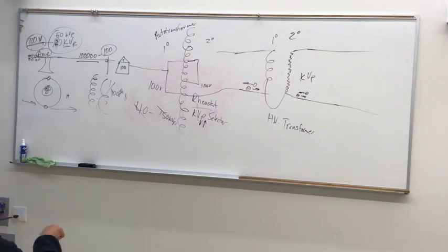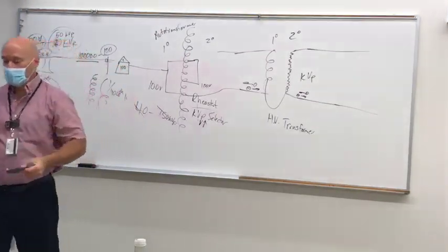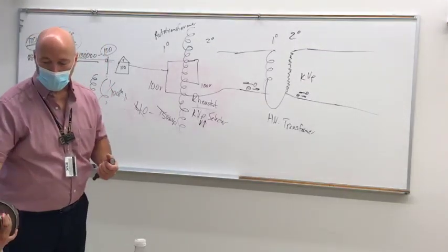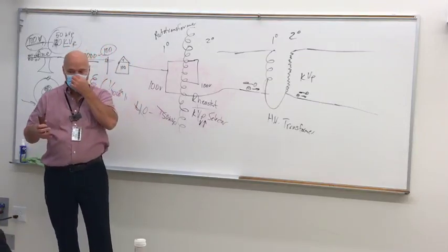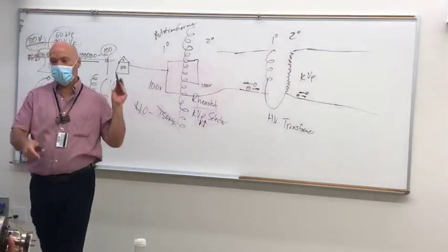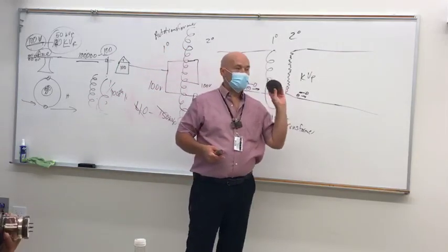Where's my filament? What I want you to do as you look at these is look inside, and what you'll see is a disc. And if you turn that tube, what you'll notice is the disc turns with it. There's a purpose for it turning. At the other end, what you'll see is what looks like a light bulb. That one's a little bit heavier, it's got an added component that we'll talk about in a bit. You probably can't see it on this one, you'll be able to see it on that one.